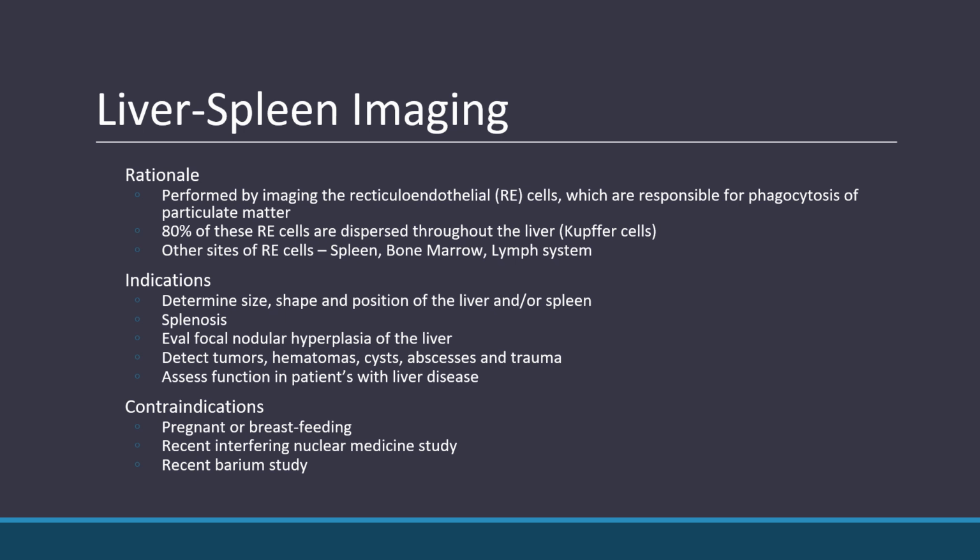And then the next procedure I want to talk about is the liver-spleen imaging. This study has mostly been replaced with other things, but you will see it a lot, especially if you work at VA systems or areas where there's GI doctors or liver specialists that are ordering the test a lot. It's done to look at liver function, but you're not looking at the gallbladder or the biliary system at all.